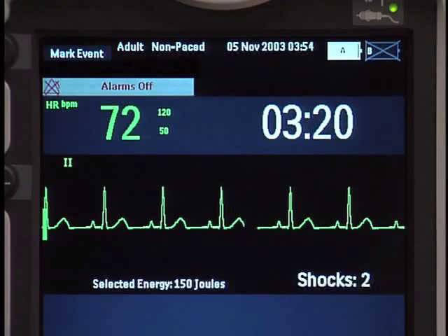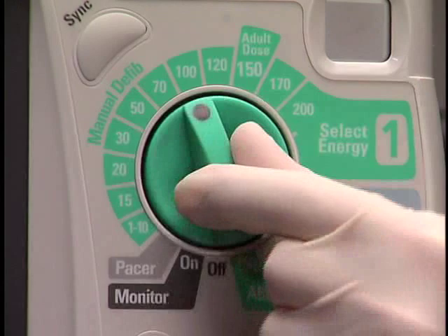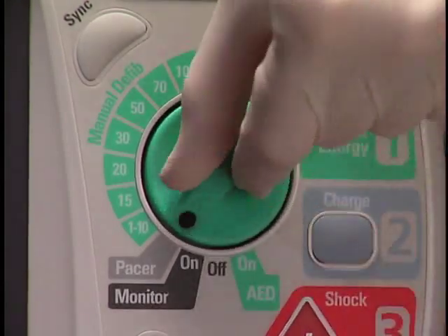Following successful defibrillation and after you confirm a stable heart rhythm, return the therapy knob to monitor.